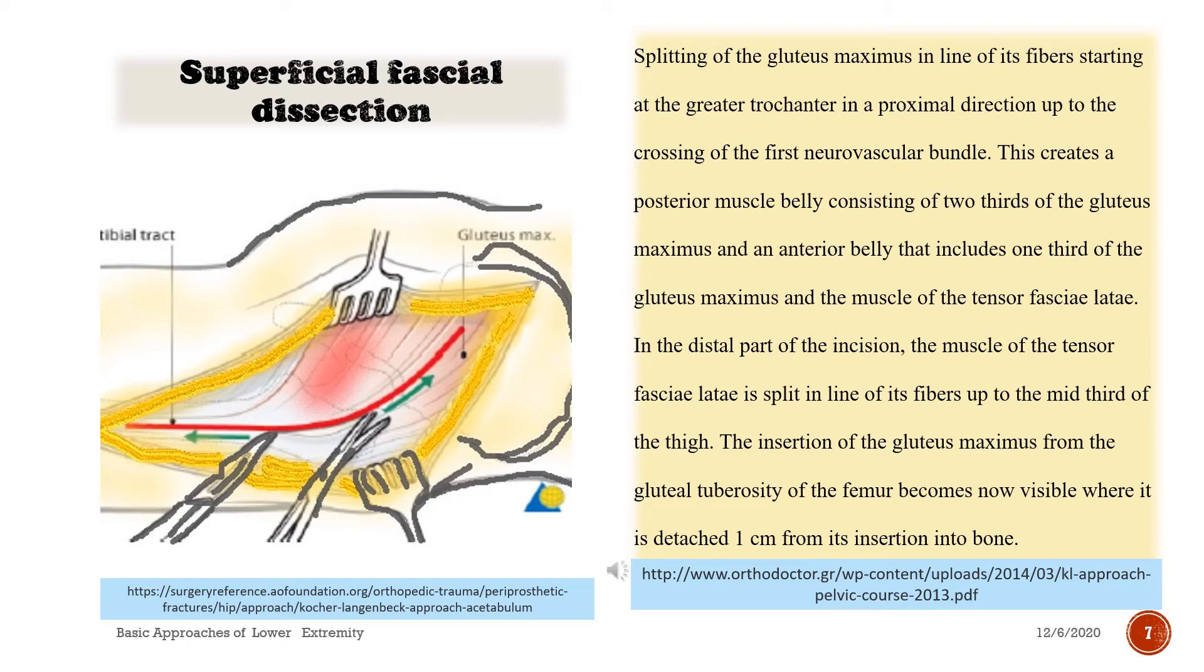Superficial fascial dissection: splitting of the gluteus maximus in line of its fibers starting at the greater trochanter in a proximal direction up to the crossing of the first neurovascular bundle. This creates a posterior muscle belly consisting of two-thirds of the gluteus maximus and an anterior belly that includes one-third of the gluteus maximus and the muscle of the tensor fasciae latae.